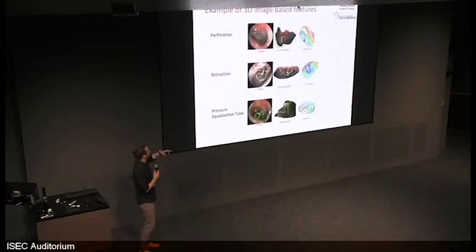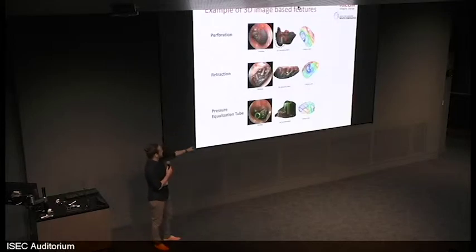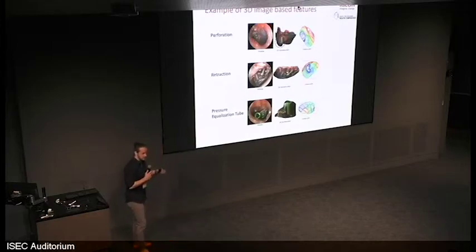To give you some examples, here is what this device can produce. We have the 2D image in the first column, then the 3D reconstruction, and an additional feature, which is a contour plot, where every color has the same depth.